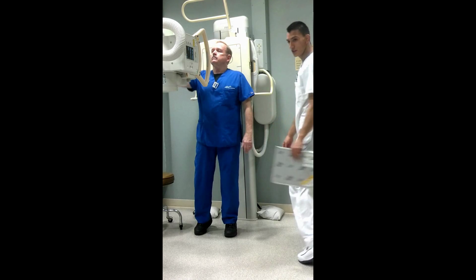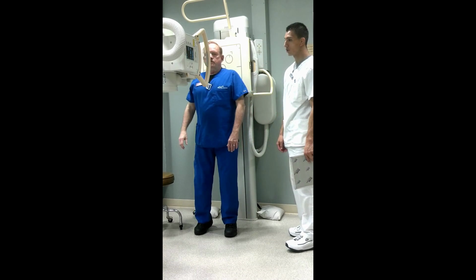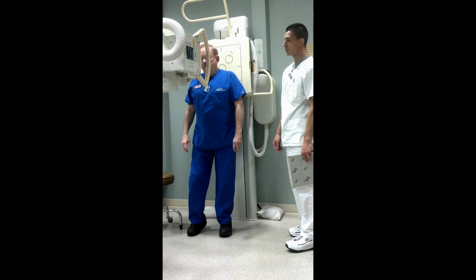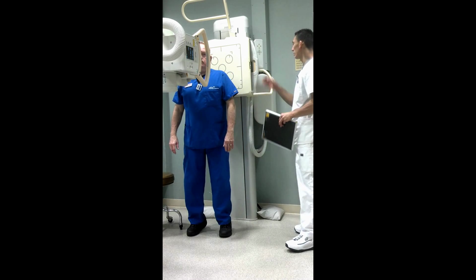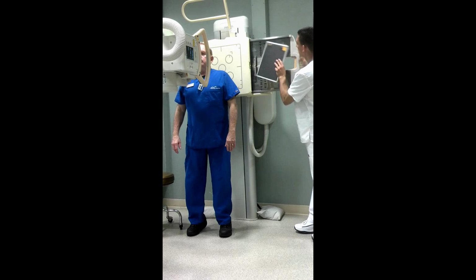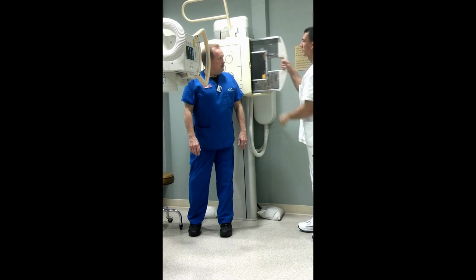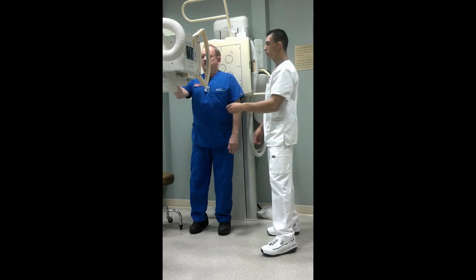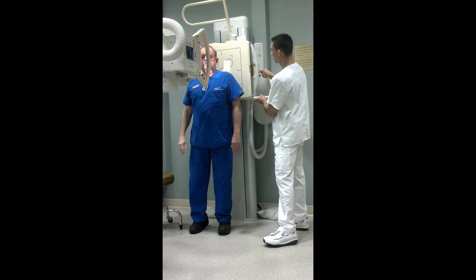Alright guys, we just finished taking our superior inferior axial view of the shoulder, and we're just going to do our series of the neutral, internal and external rotation of the arm for the shoulder. So I got my IR here, putting it crosswise to the bucky. And so for the neutral, I'm just going to make sure everything is lined up, the tube with the bucky.